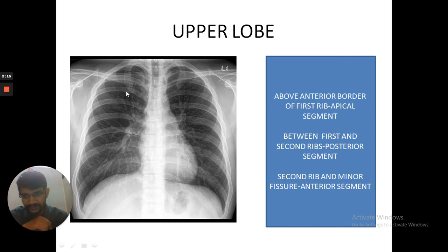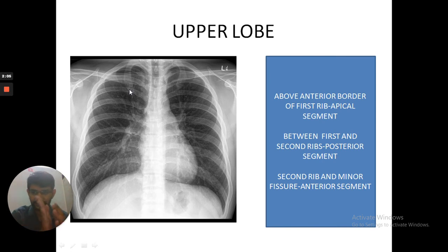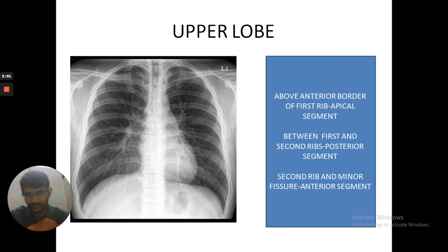You can see the anterior ribs numbered one through six and the posterior ribs. We are mainly concerned with the anterior ribs. If the lesion is above the anterior border of the first rib, it is in the apical segment of the upper lobe — bilateral.